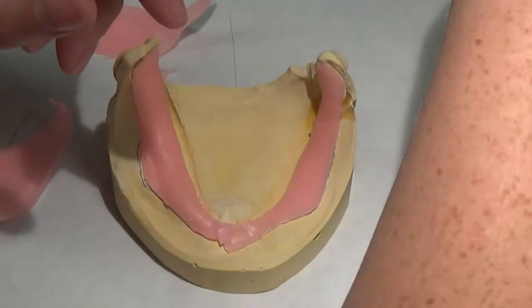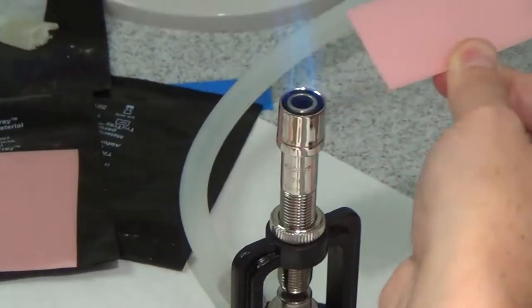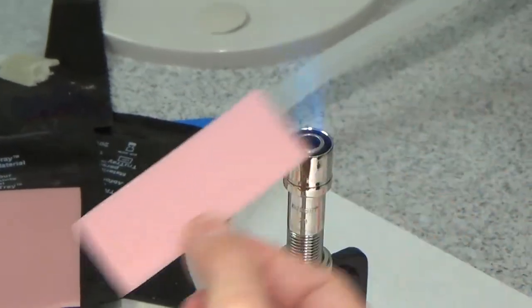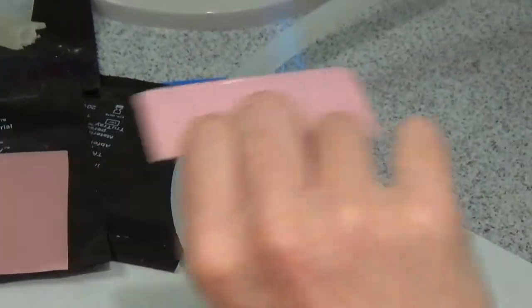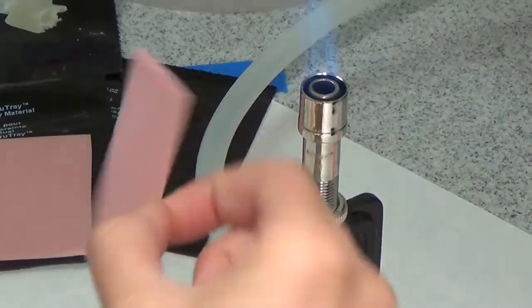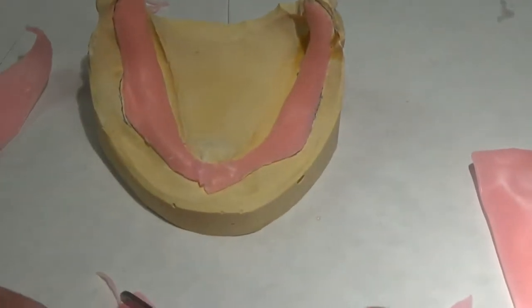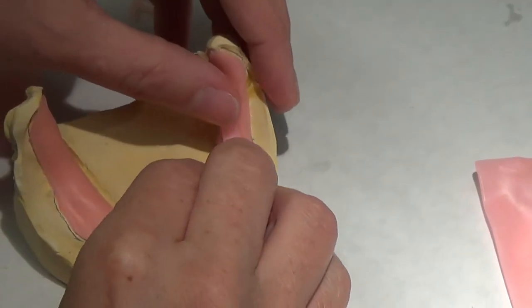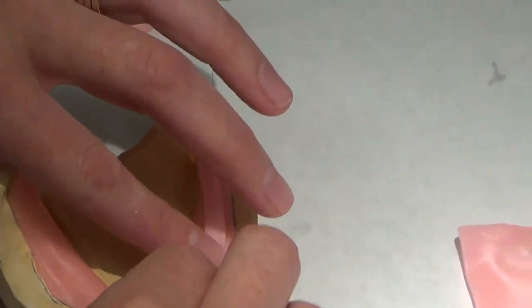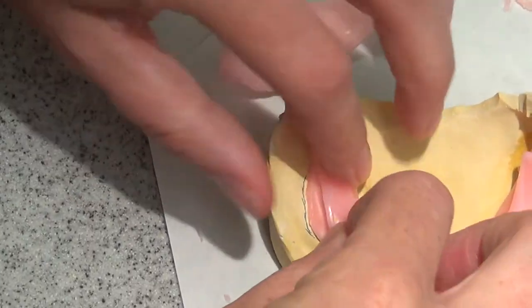So I'm going to come back and do just another thin layer — you're going to see I'm going to really thin it out. I'm going to get it a little bit warmer than I have been, so it's more running than drooping. I'm going to do a super thin line and put it right over top of that ridge back there and right over top of the ridge right here.